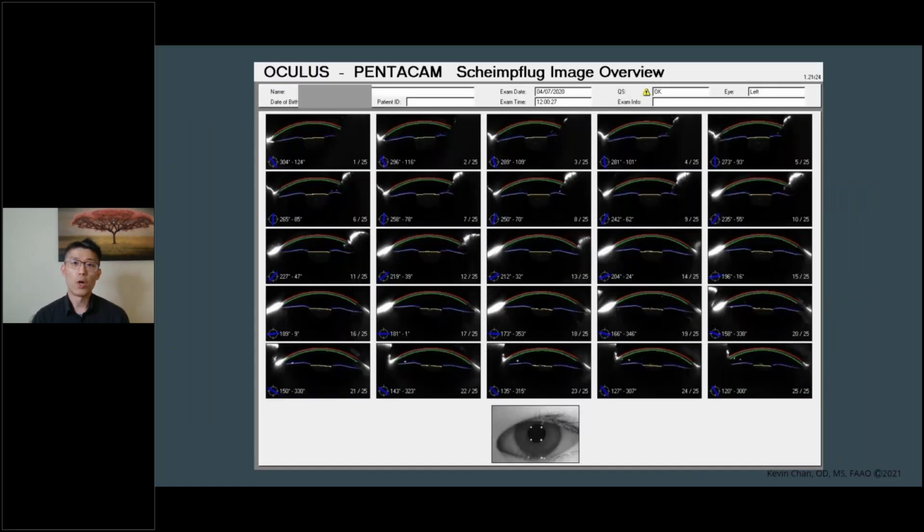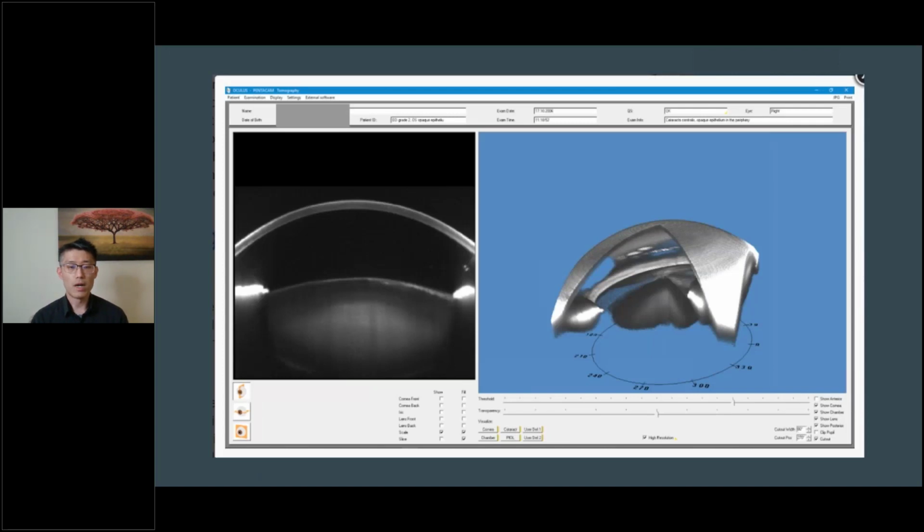Here they are. After I take the single imaging shot, we're able to see all the different anterior segments. After we image the patient, we're able to capture all this data and composite it into a 3D model. The tomography helps us understand from the inside out, and this is also a really good educational tool for parent and patient to understand.